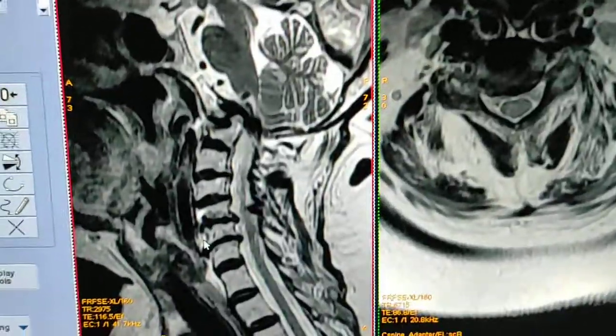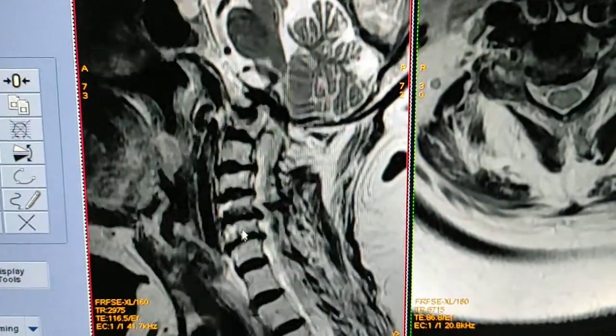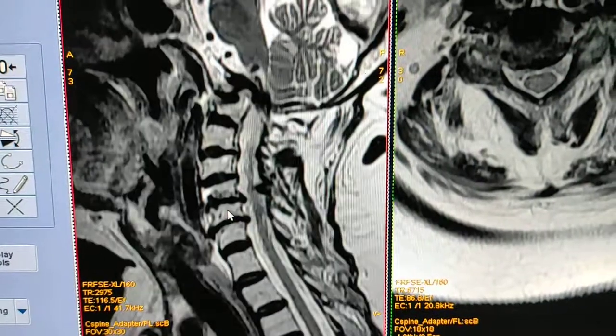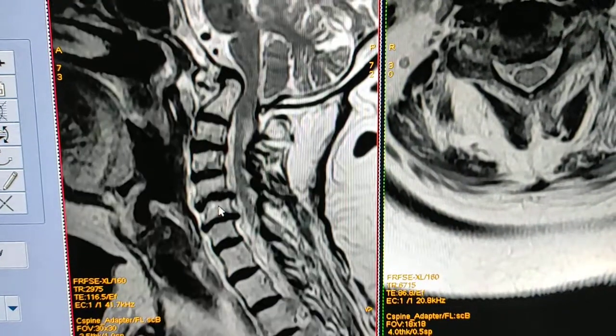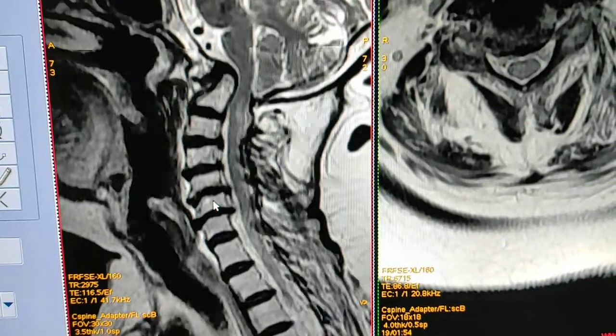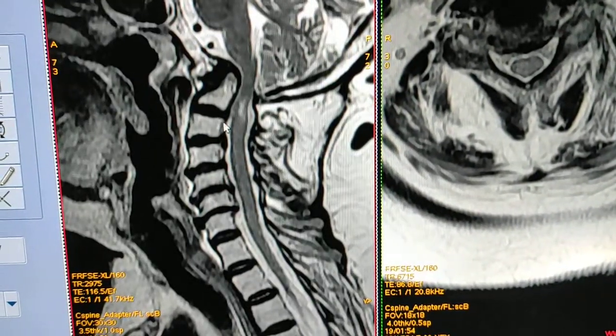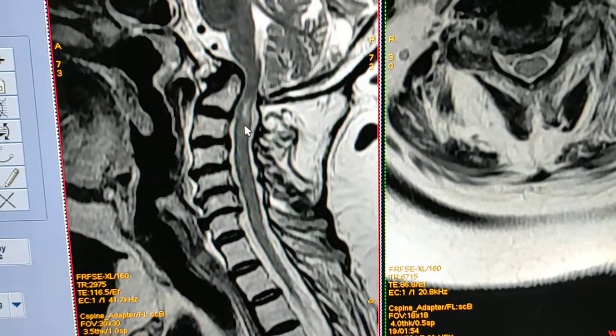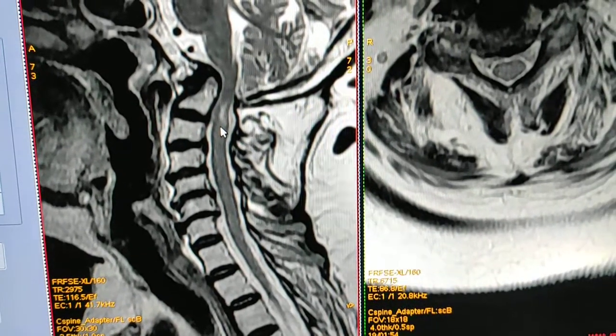See sagittal T2 weighted — this is the signal in the spinal cord. Thank you.